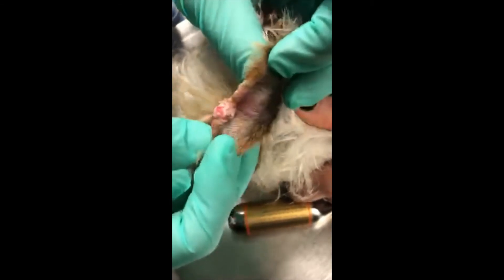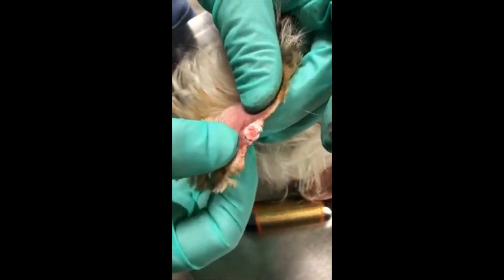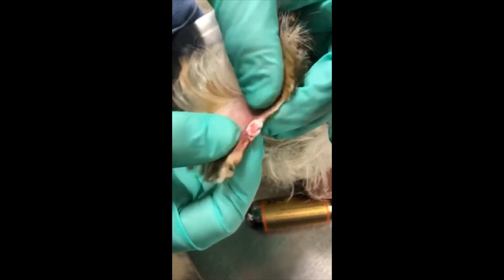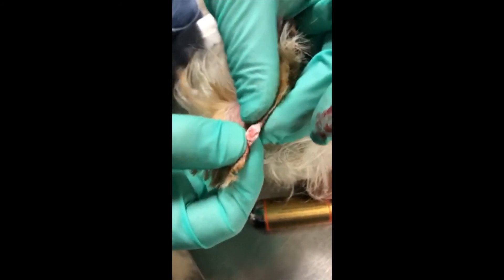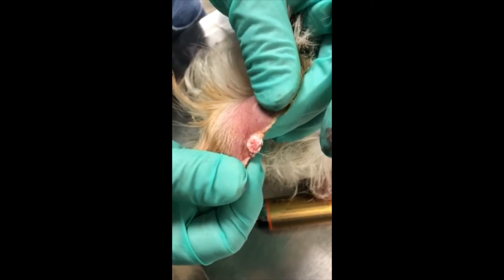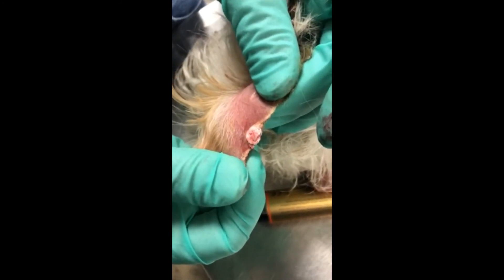Post-freeze cycle, it'll probably take in this particular ear about two minutes to thaw. We sometimes see some serous oozing and on a rare occasion some bleeding. I have clients just utilize a little styptic to prevent any bleeding in the house.